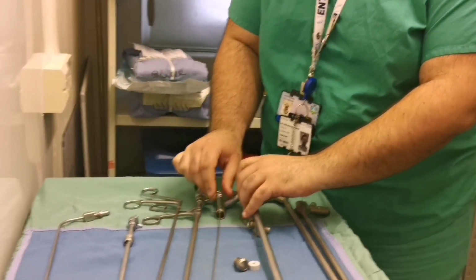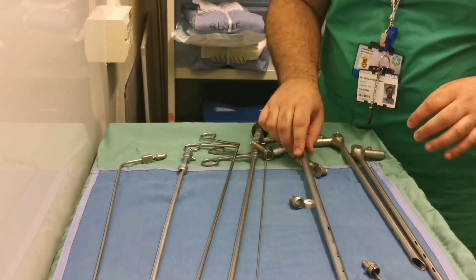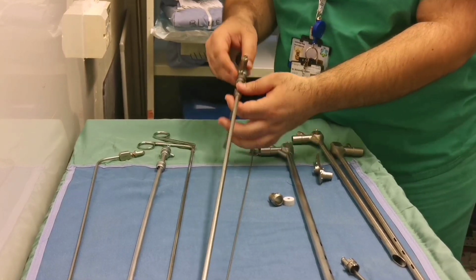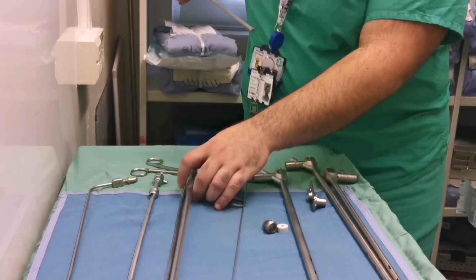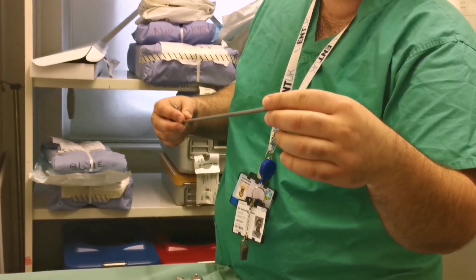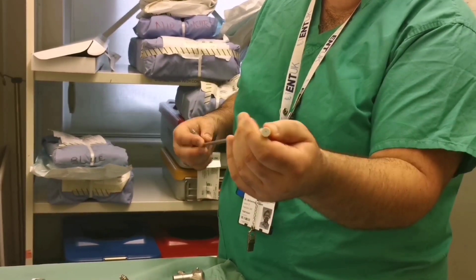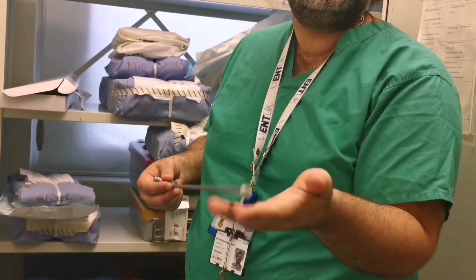One more thing, on our set, we don't have a sheath to protect the lens. So what we're going to do is use one of the plugs, just to protect the end of the lens, so it would not be bashing against the tray when it's being sterilized.